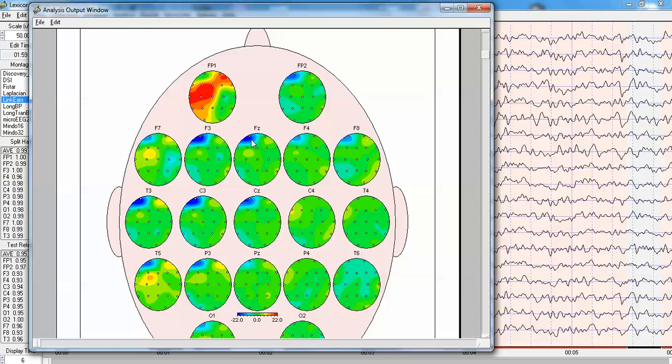F3, FZ, FP2, F4, F8, T3, C3, and CZ, but no net flow to the areas that were damaged, which are in P4 and the C4 region.